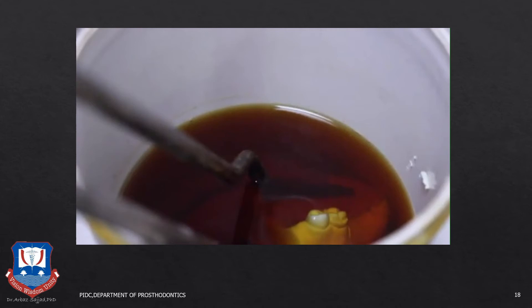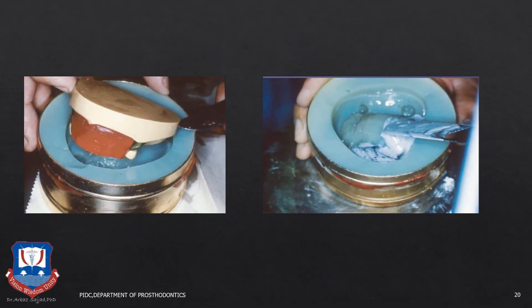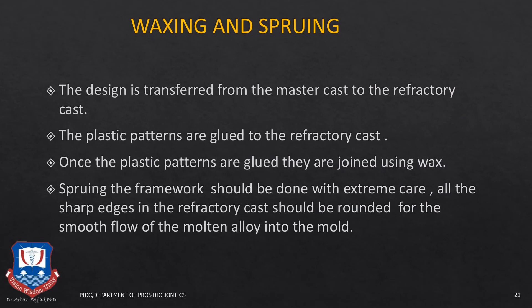The refractory cast is then dipped in beeswax because refractory casts are highly rough and porous owing to the particle size of the refractory material, so in order to get a smooth surface this last step is carried out. Once the refractory cast is obtained, the waxing and spruing can begin. The design which was drawn on the master cast is then waxed up using prefabricated wax patterns and different gauges of casting waxes onto the refractory cast.